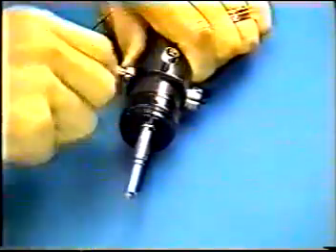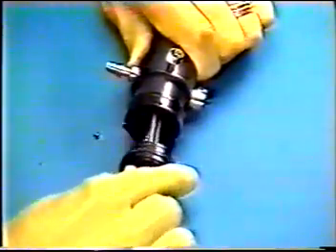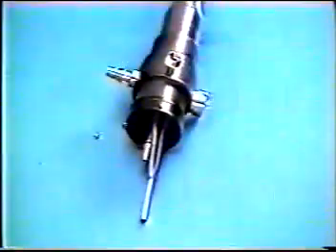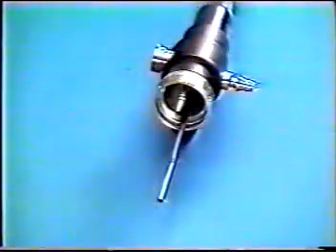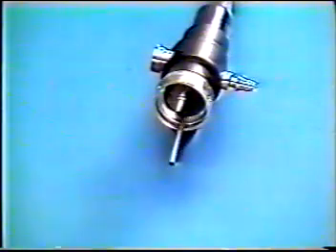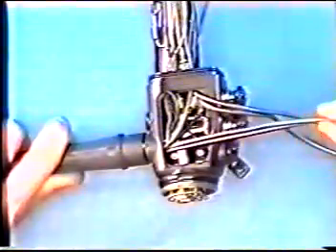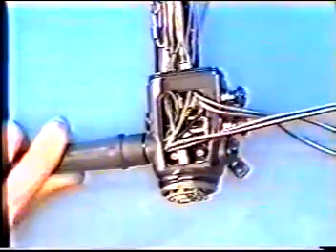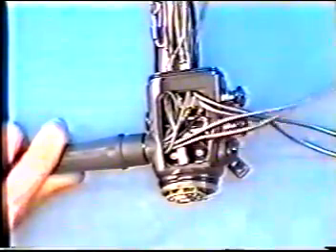And gently pull out LG guide assembly. Make sure it can be extracted smoothly. Pull out LG from flexible section slowly and carefully. Be sure that the flexible section is set straight.